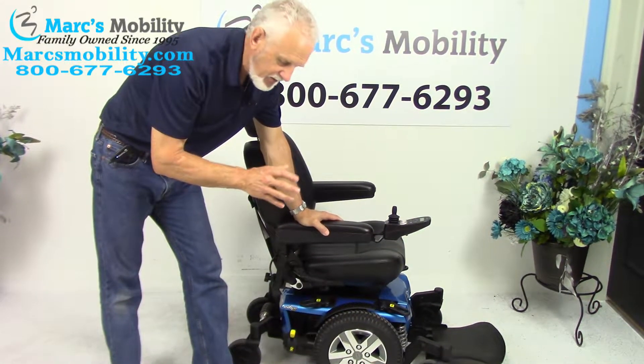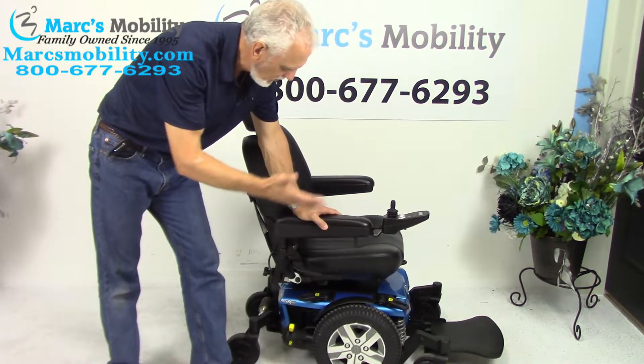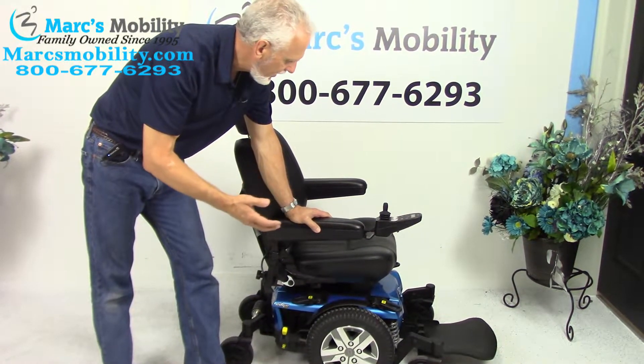This chair was used probably for about 2 or 3 months. There's no wear on it to speak of — practically brand new.